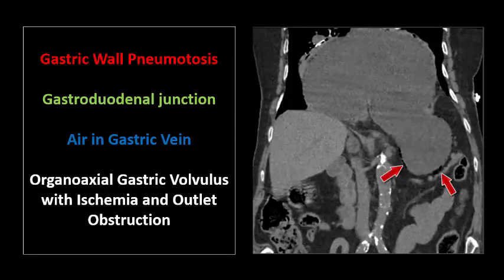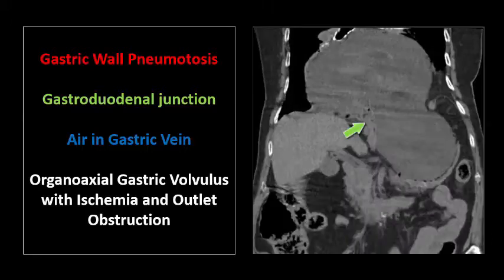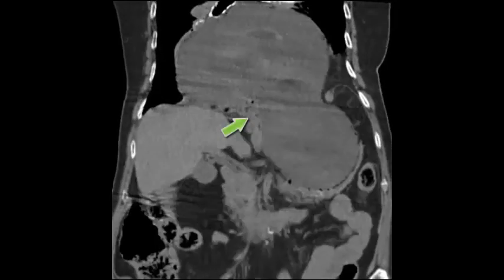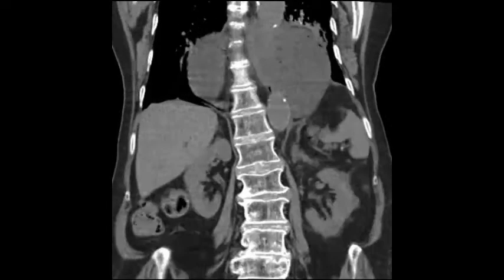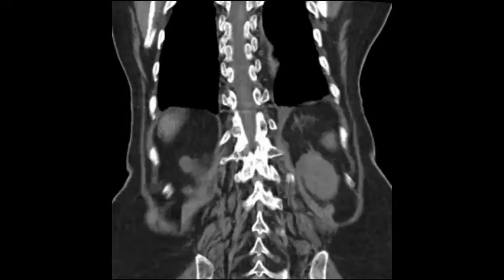The coronal images show the extent of gastric dilatation and gastric wall pneumatosis. Also note again how the gastroduodenal junction is herniating, causing the gastric outlet obstruction. Here is the coronal cineclip. You more easily see the reversed or upside-down orientation of the stomach with the greater curvature above the lesser curvature, which is typically how organoaxial gastric volvulus is described.